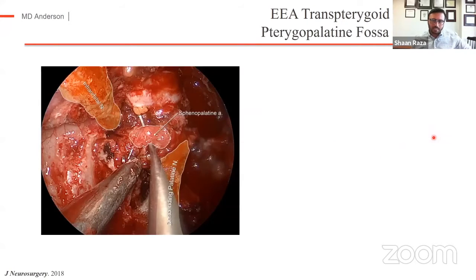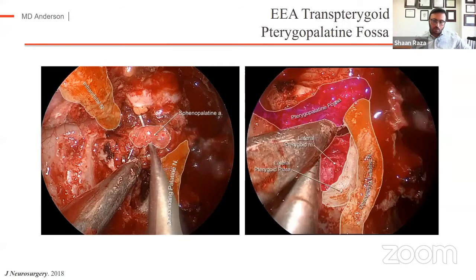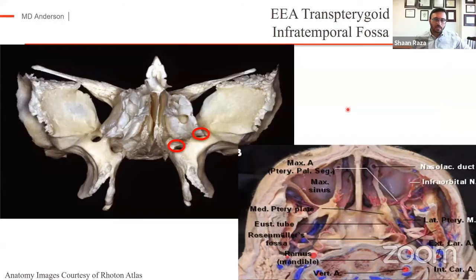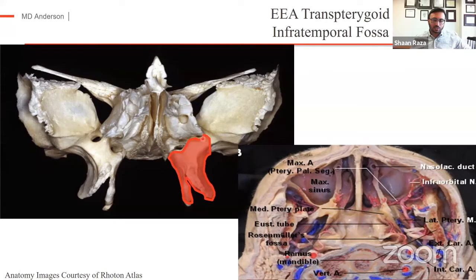The next key step is dissecting out the pterygopalatine fossa contents. The distal branches of V2, the infraorbital nerve, and the descending palatine nerve you want to preserve throughout the dissection. The vascular compartment of the PPF is dissected where the distal branches of IMAX are identified. I typically clip the sphenopalatine artery. Then working through the posterior periosteal sheath of the PPF, you gain access to the infratemporal fossa. The dissection focuses on the inferior head of the lateral pterygoid muscle, detaching it in a subperiosteal fashion from the lateral pterygoid plate, and then V2 exiting foramen rotundum is identified to isolate the medial and lateral pterygoid plates.